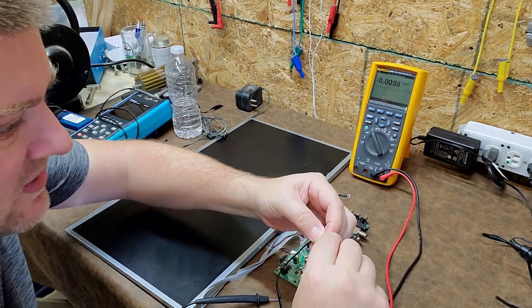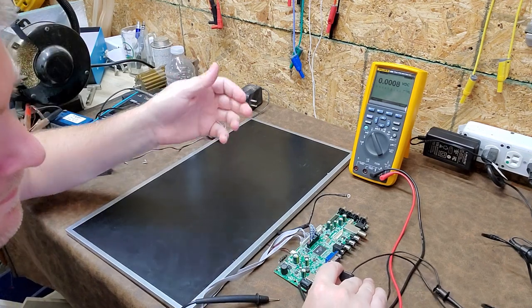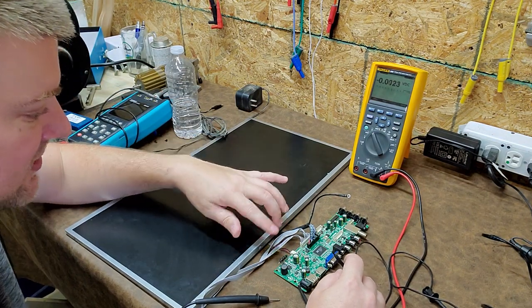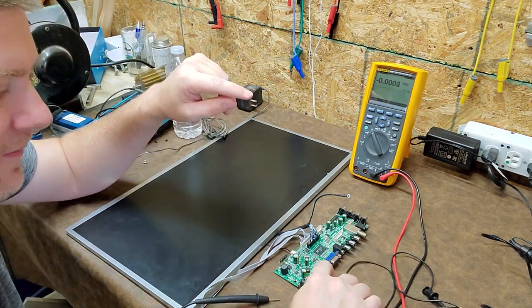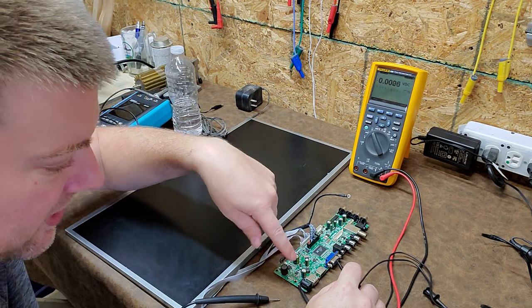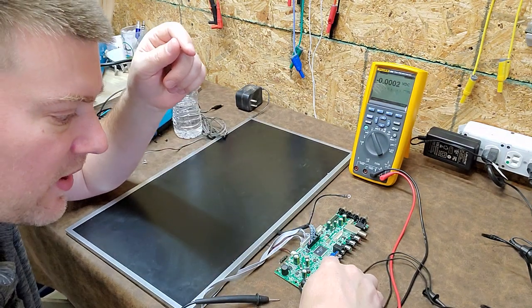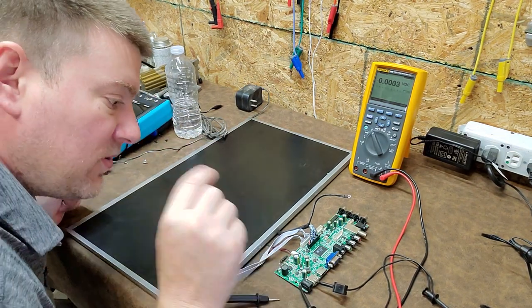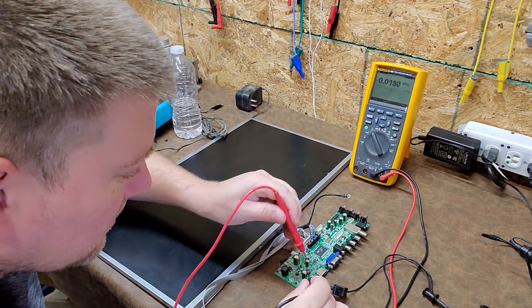Now, mind you, I am testing this in my shop, and this isn't a major thing since it's just a TV. It's basically an RV TV, if you want to think about it. RVs, conversion vans and stuff, they all run off 12 volt. So if you ever need to replace one of these TVs, that's where I would look, as RV and van TVs. And for negative, on this one here, I've already checked for commonality between the negative post on the DC jack and pretty much any of the ground. So I'm going to go ahead and clip right here and connect it on the USB outer shroud. So I'm running through the fuse, and I've got a common ground through the USB shroud. So let's go ahead and test it right now.